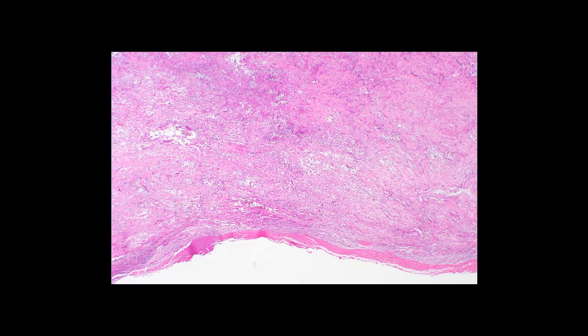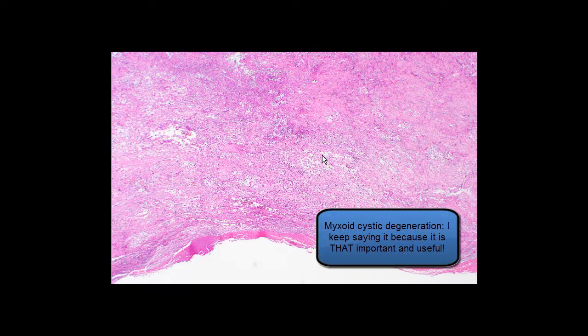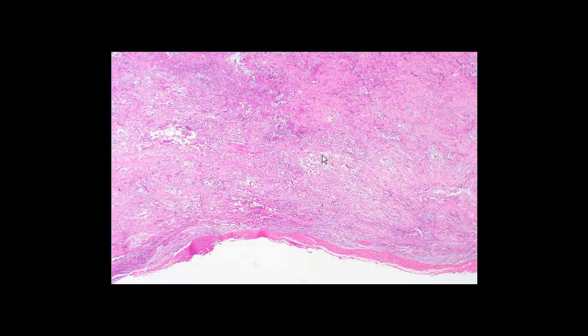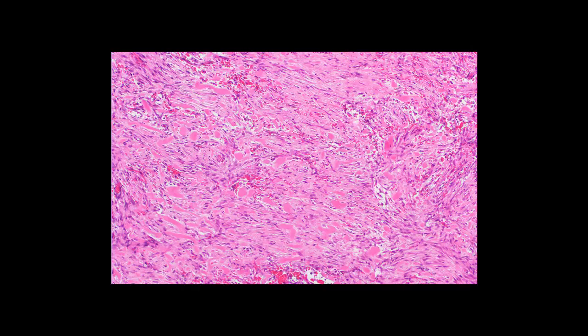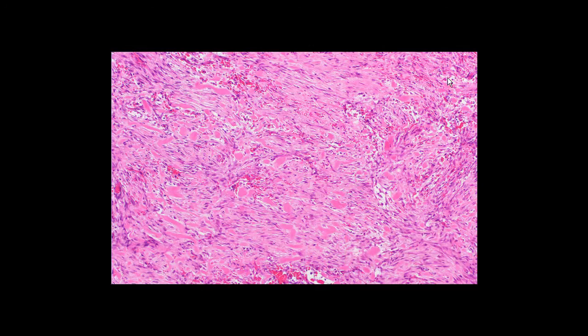Here's one final example of nodular fasciitis. You can see this dense pink layer at the edge of the proliferation — this is fascia, and from the fascia the nodular fasciitis is arising. Again, you can appreciate the myxoid cystic breakdown, which we've seen in every example today. In this case, the background is very pink and fibrotic. At higher power, you can see a very collagenous background with dense keloidal collagen bundles, small myxoid cystic spaces, and abundant extravasated erythrocytes.